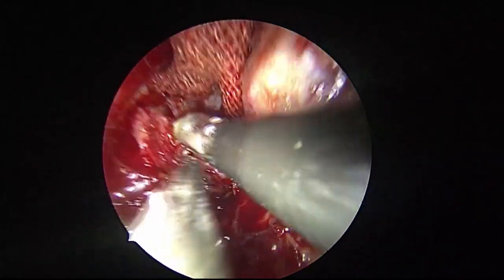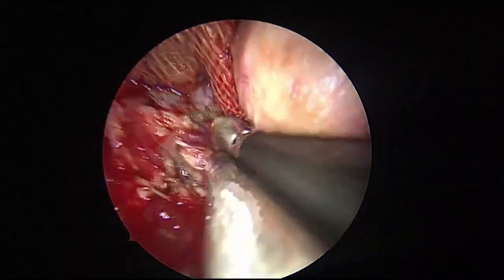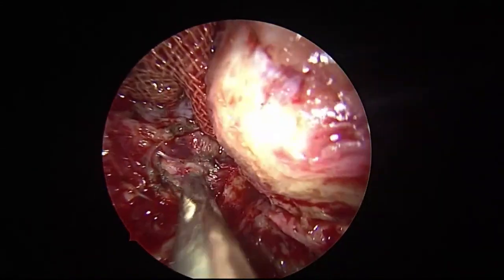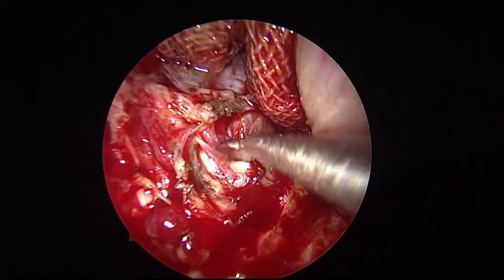So you are doing a four-hand technique now? Not really. My assistant is using one hand to either irrigate or suction in between. Okay, okay, sir.